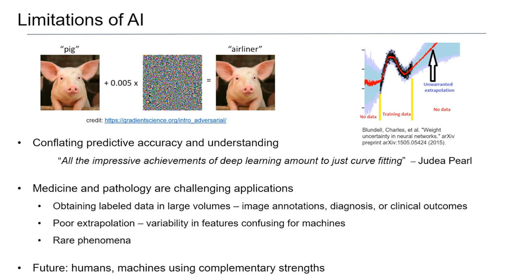Nothing is guaranteed. And so, in pathology, because of the tissue processing, we use a lot of very noisy mechanical and chemical processes. There's a lot of pre-analytical variability, which leads to extrapolation. So the quality of the images change, the colors change, and then, all of a sudden, the algorithms stop working. And so that's really, I think, what we're contending with now and what's causing a lot of failure of these technologies. They look great in one data set, you apply them in another scenario, and they completely break down.